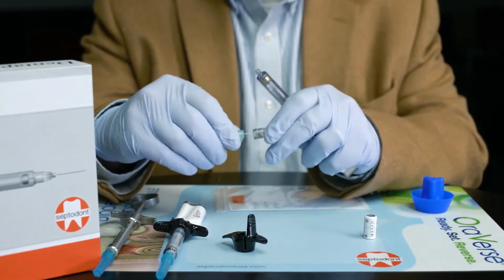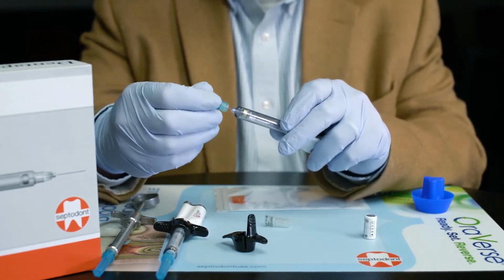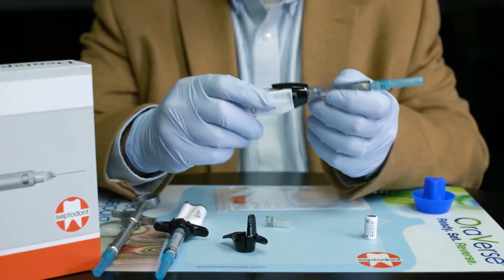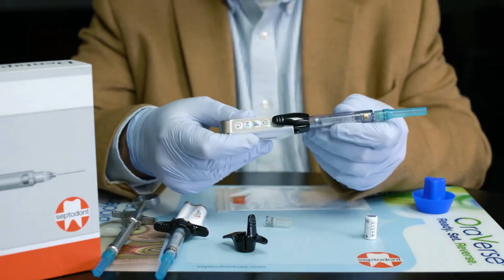Any standard dental needle will work. I always use Septodont needles. They're the best. Now turn it on, and I'm ready to go.